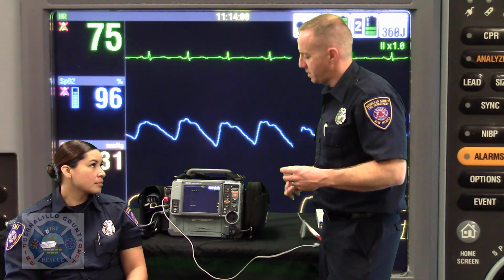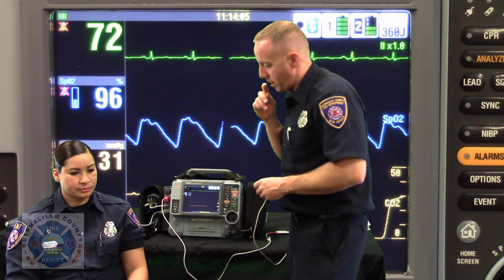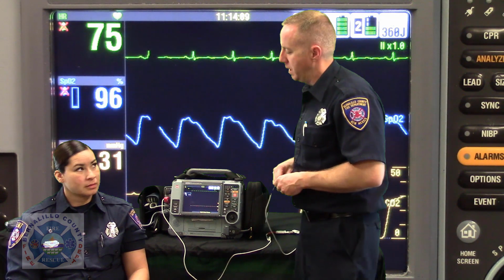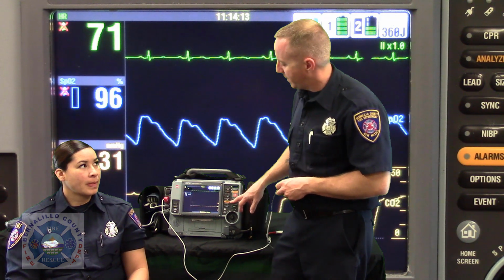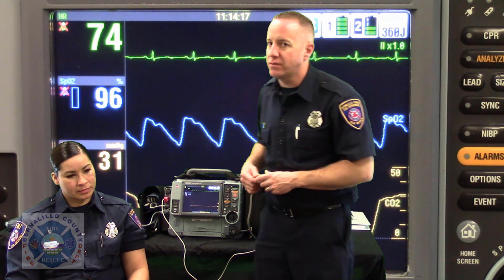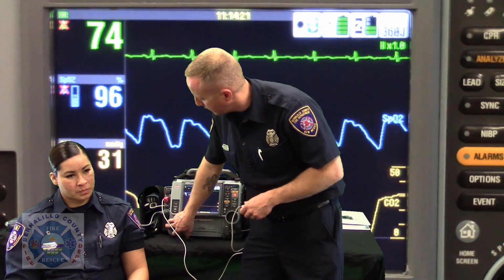Now that we have a simulated patient here, we're going to transition over to our NIBP cuff, or non-invasive blood pressure. Now, the reason that they have to make the distinction with the Lifepack 15 between the non-invasive blood pressure monitoring and invasive blood pressure monitoring, which would be IBP, is that there is an option here that you might appreciate.